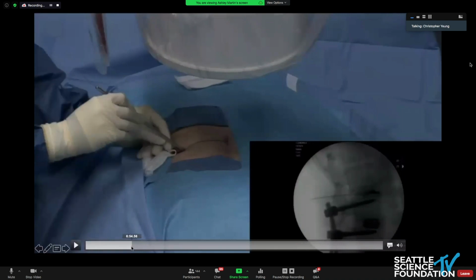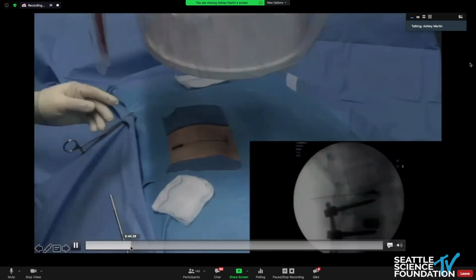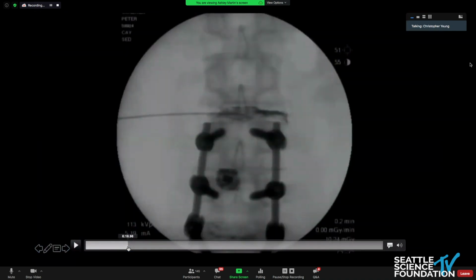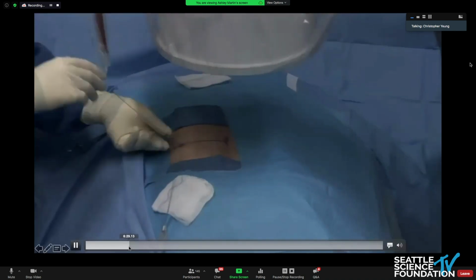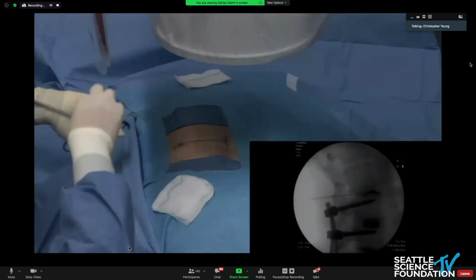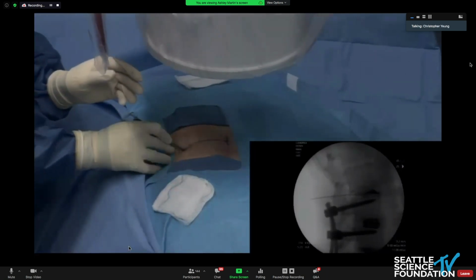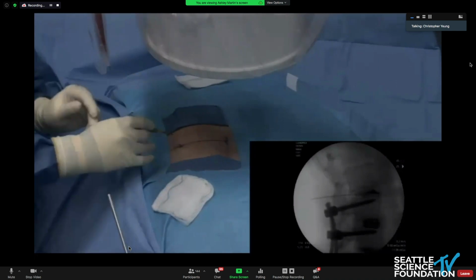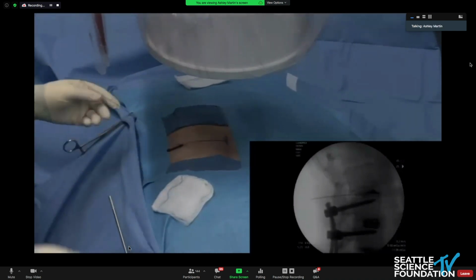Okay, so this is just kind of showing the steps. All right, I'll rewind just a little bit more. We'll typically inject some blue dye, usually indigo carmine dye, and that helps selectively stain the nucleus. It helps orient you because the nucleus is stained blue.